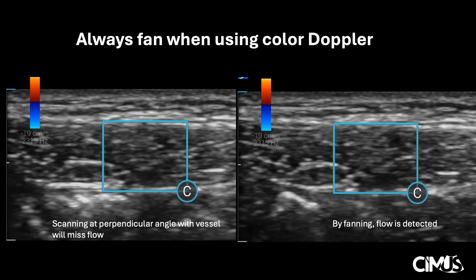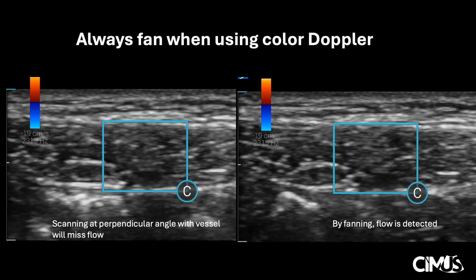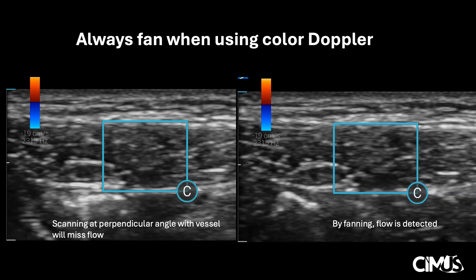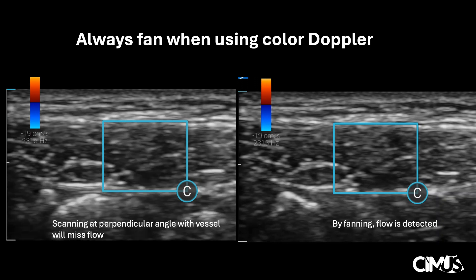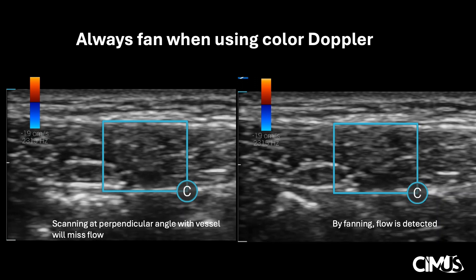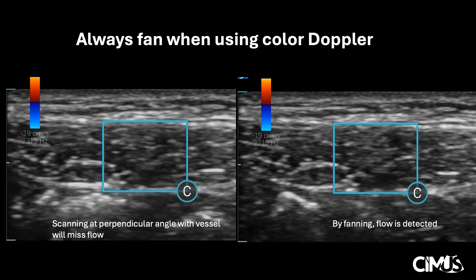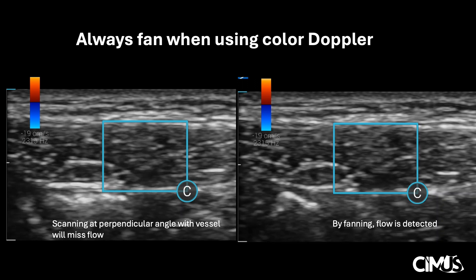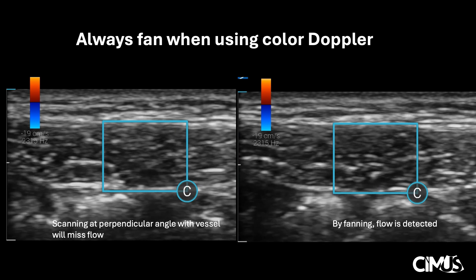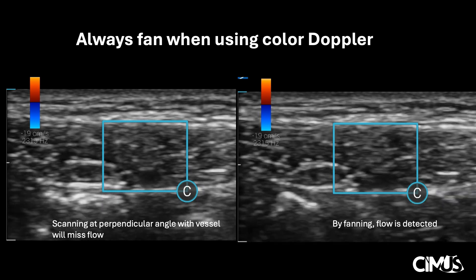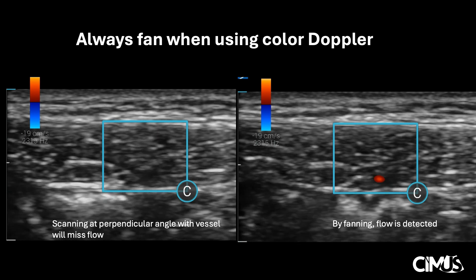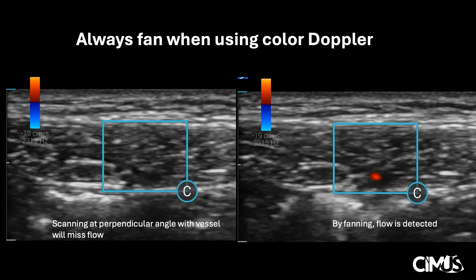As we mentioned, with color Doppler but not with power Doppler, scanning perpendicular to the vessel has the potential to miss flow due to a 90-degree angle of insonation. Here on the left, you may be fooled into thinking there is no vessel in the area, when in reality no signal is picked up because the transducer is scanning directly perpendicular to the angle of the vessel, resulting in missed flow. On the right, the operator fans the transducer, changing the angle of insonation, resulting in flow being detected. It is therefore important to always fan through structures, particularly when using color Doppler, to avoid missing vessels.